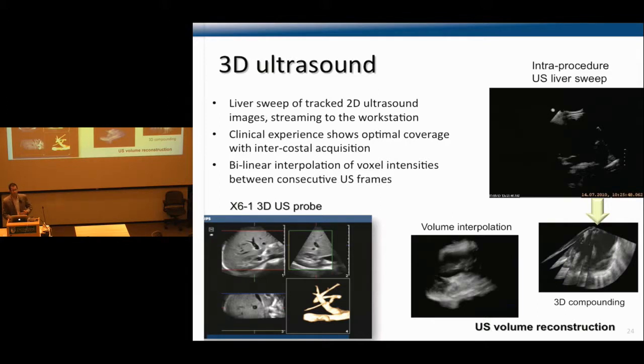So if we have a patient that has a biopsy, a free breathing biopsy, he's not under sedation, the interventional radiologist will ask the patient to hold his breath, which is not necessarily guaranteed. So when we do a sweep, we might see some artifacts which bring in some errors in the 3D reconstruction. If we compare that to the 3D probe, in a fraction of a second, we're able to get that 3D volume and avoid these artifacts due to breathing motion during the reconstruction process.